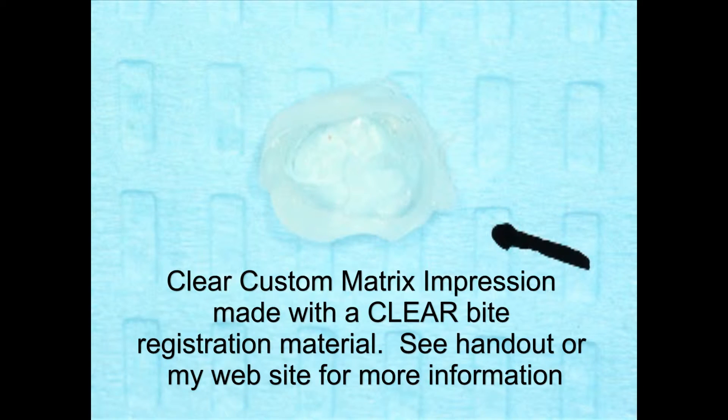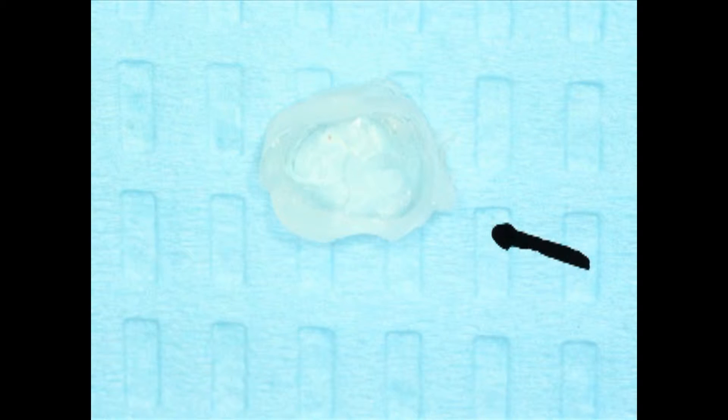I made a custom matrix impression inside that matrix band, and notice this little what I call a fin coming out from that custom matrix impression. That's where the matrix band went into the matrix retainer. This fin is very helpful, because without it you would have a hard time telling what is the buccal and what is the lingual of this custom matrix impression. This allows me to set it back inside the matrix band in the correct way.